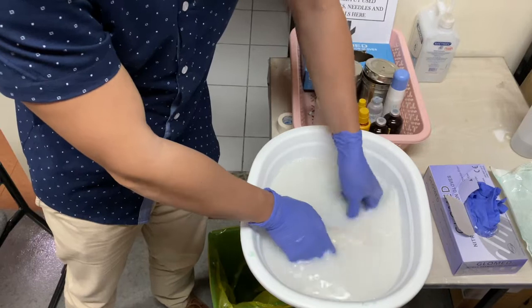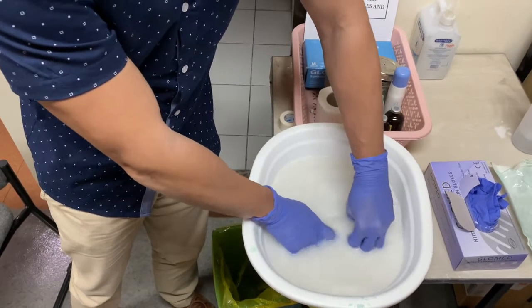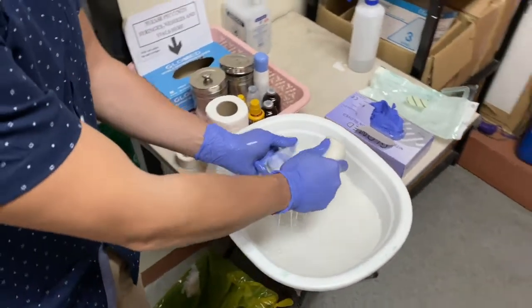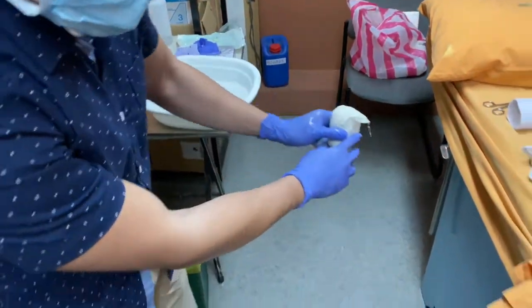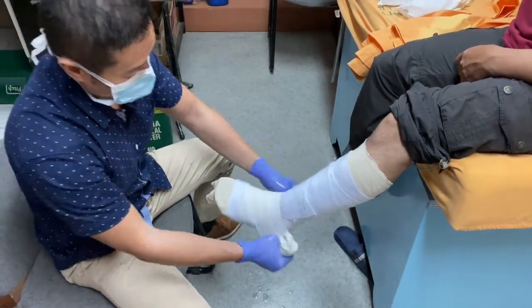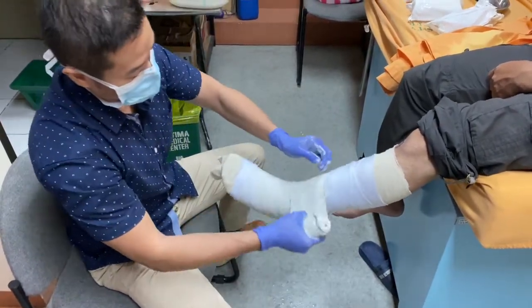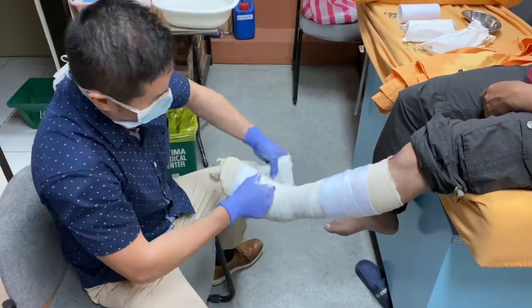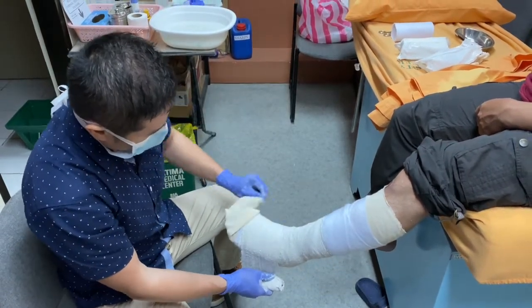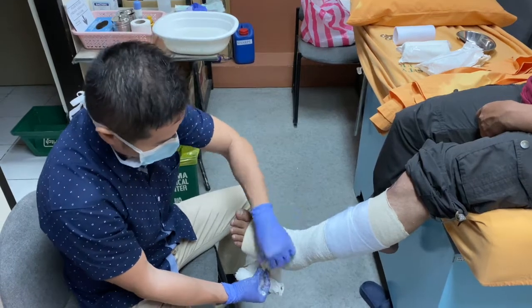In some cases, some doctors cut the cast roll into two to increase the surface area exposed to water — that is normal. Once ready, we start applying from the area you want to mobilize — start at the ankle or the foot. After about two to three layers, you can roll back the stockinette over the cast edge.